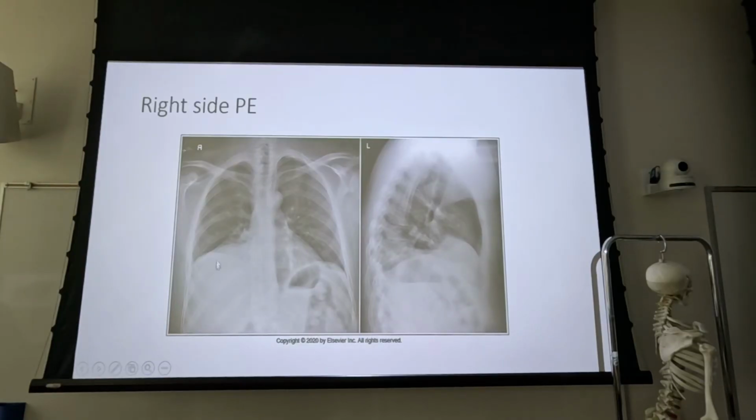Pleural effusion. So evaluate that as well on your PA. If you've got separation of diaphragms, it's because we have a compressed lung. With pleural effusion, it's definitely going to compress the lower lobe. Remember, we've got three different terms we don't want to conflate. The term for collapse of the lung is atelectasis, right? So don't confuse that. You're going to get that all the way through the registry. Collapse of the lung is atelectasis.